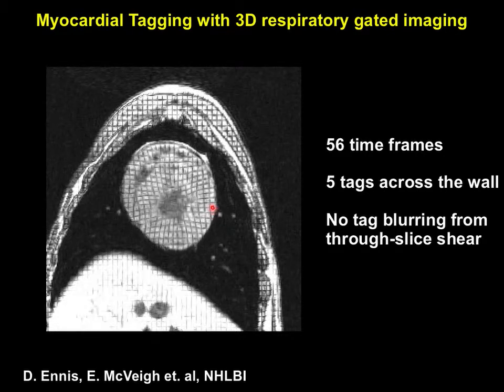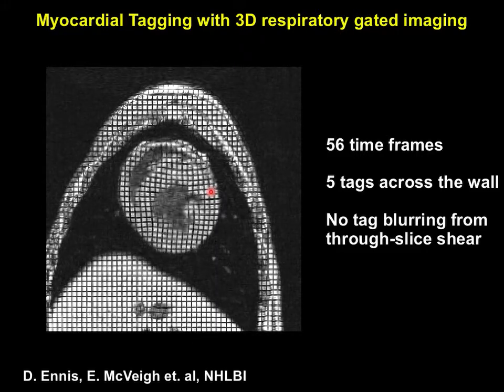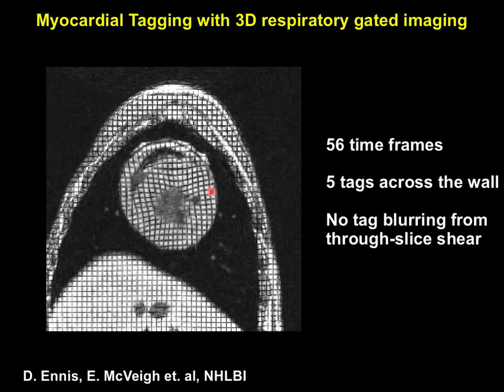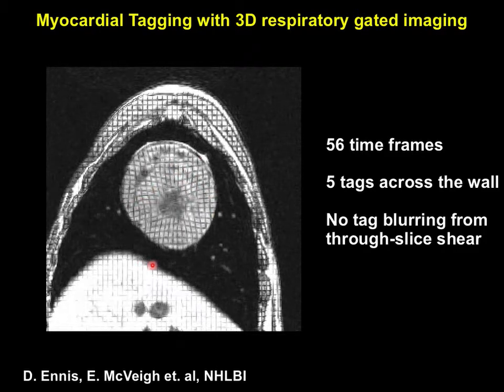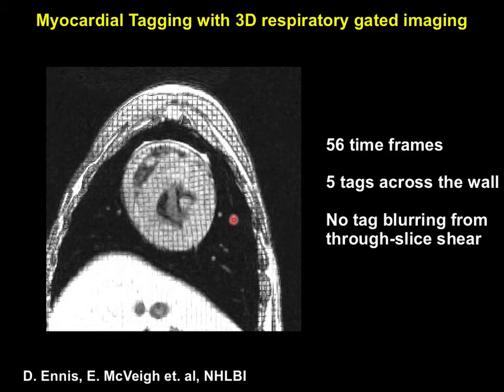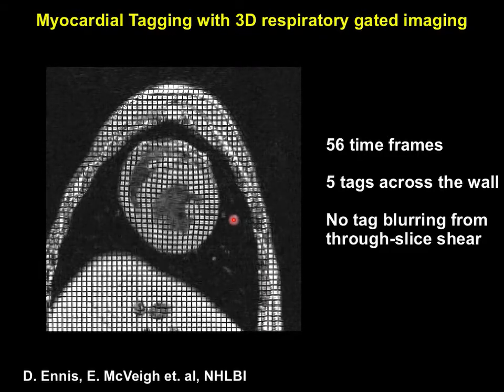However, I would argue that when you implant a set of gold beads in the myocardium, that's a significant perturbation to the myocardium. I would assume that we would see edema and all sorts of things. And so this is completely non-destructive, non-invasive. A lot of work has been done. This is called myocardial tagging, and a lot of work has been done to measure myocardial function with it.